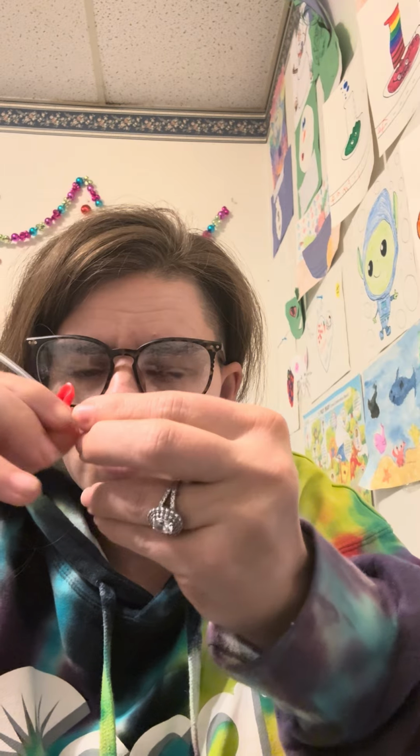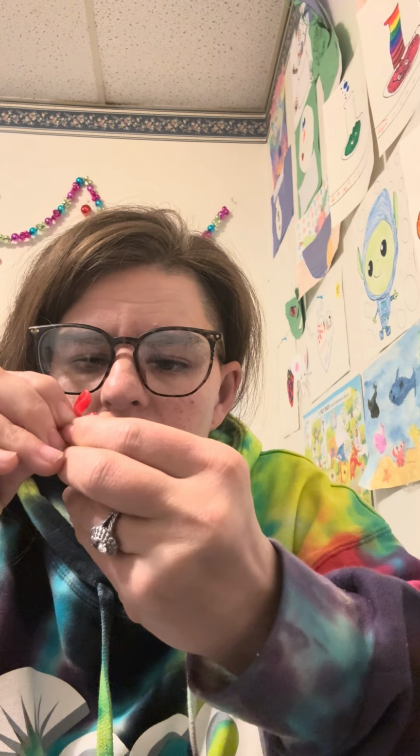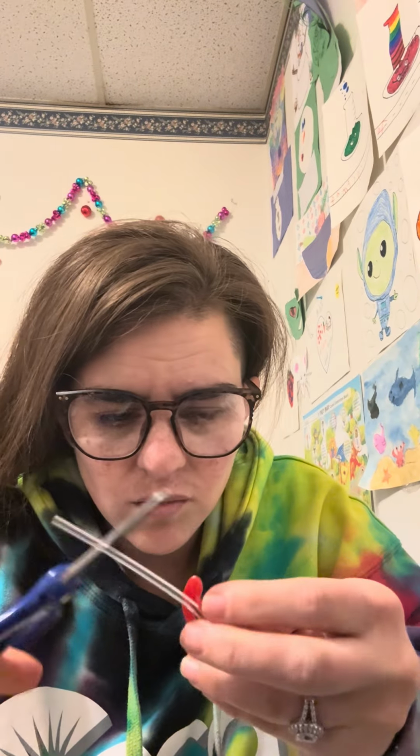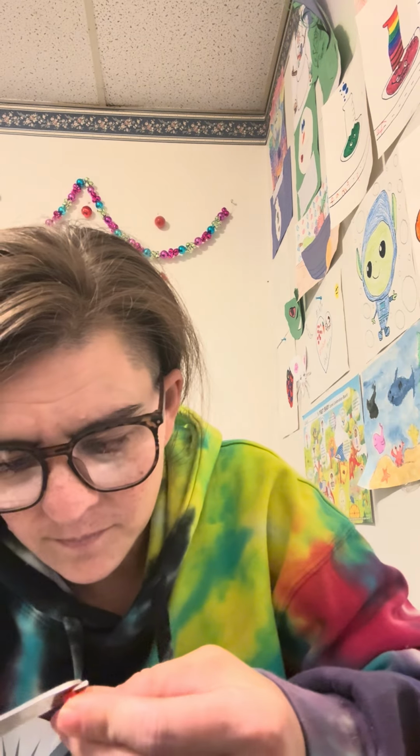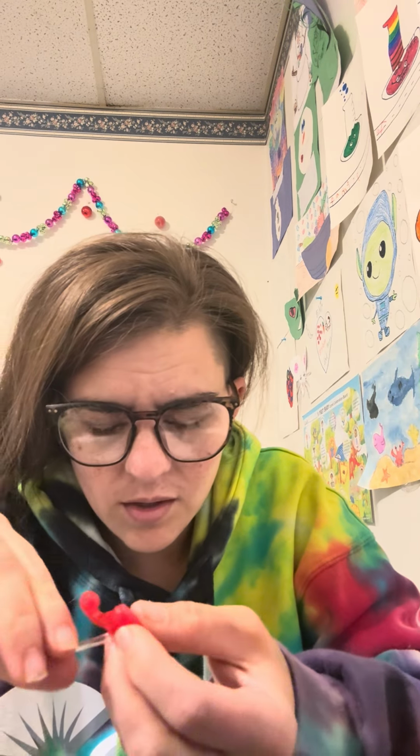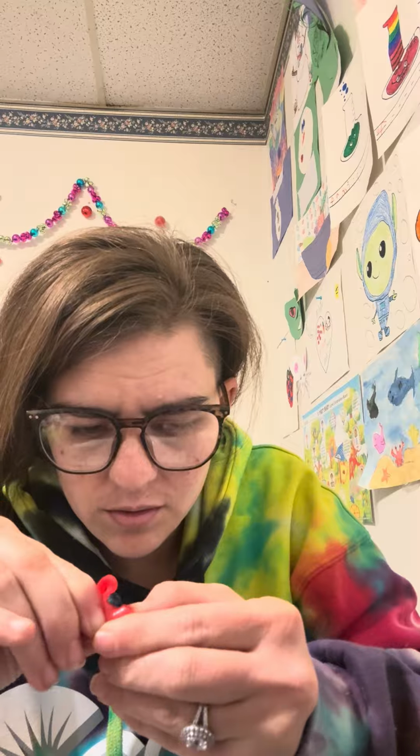But you want to make sure that you get a 90-degree angle or as close to it as you can. So there it is. It looks like I need to do one more trimming session. So I'm going to trim it down. Okay, and there it is. This is how mine looks.